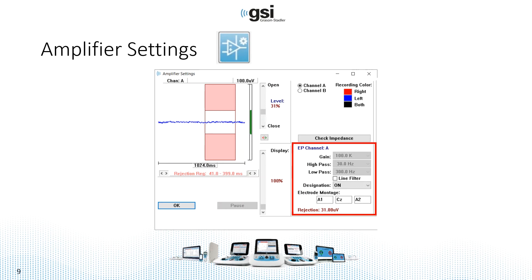But for ASSR, they're fixed. So you can't change the gain. It's 100,000, and the high pass and low pass filters are 30 and 300 Hz.